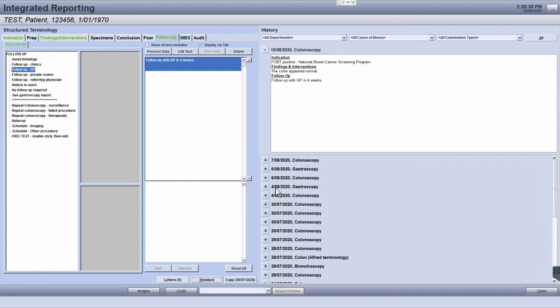After you've populated the report, go into the standard report window by clicking the standard button again.